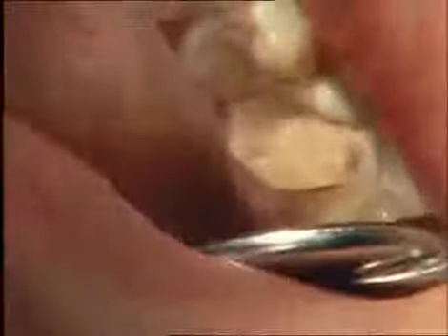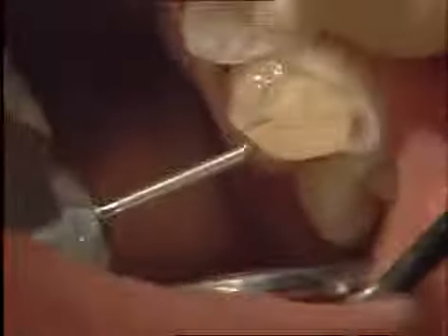Ideally, the tooth is built up immediately following the endodontic treatment by means of a bonded composite restoration, if enough tooth structure is left. In this way, it is ideally prepared for further restorative procedures. This is done in a total etching technique, followed by suitable dentin bonding agents. The tooth is checked for any interferences during centric occlusion and excursive movements.